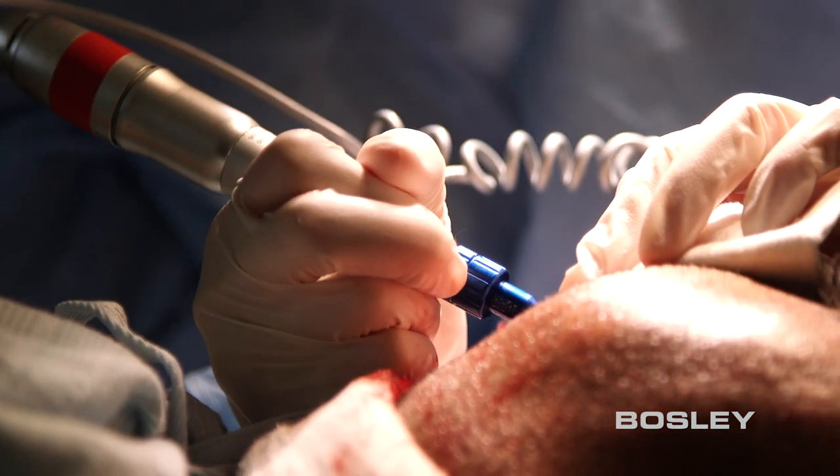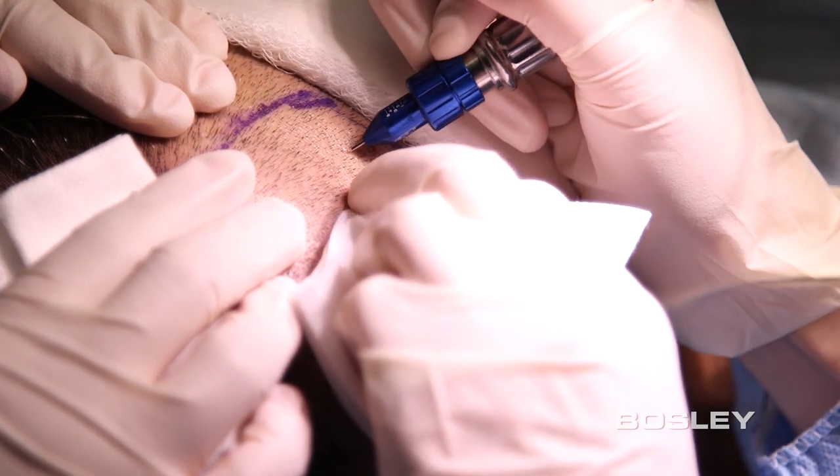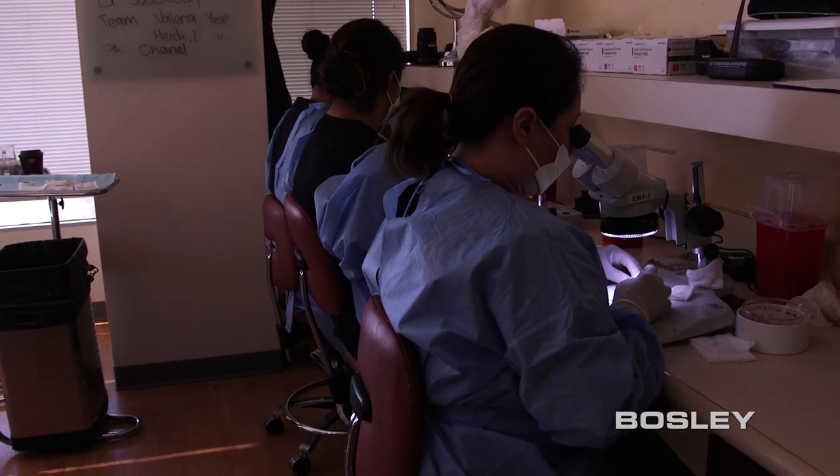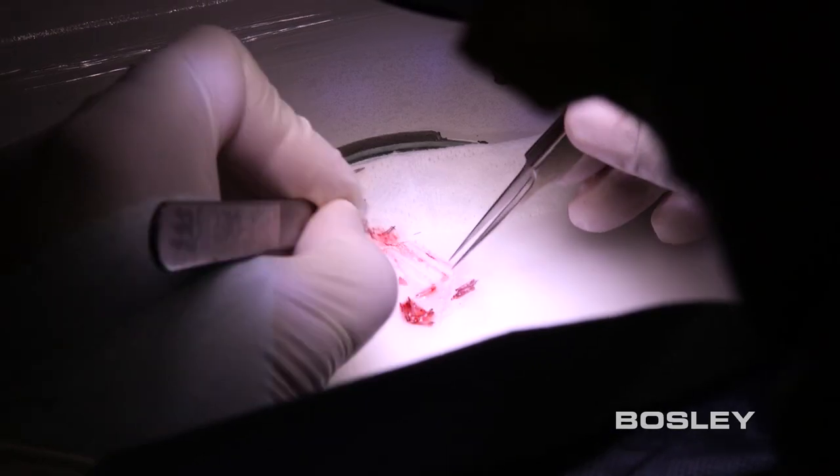We'll start by extracting individual grafts, or follicular units, from the donor area. We then separate the grafts into categories based on the number of hairs in each graft, each with a specific purpose.